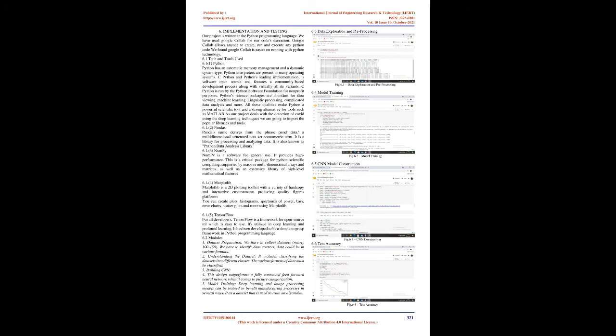5.6 Architecture Diagram. We'll start by gathering the COVID and normal datasets. Those X-ray pictures should be used as input layers. With ImageNet, we may utilize any of the three pre-trained models: ResNet 50, VGG16, and VGG19. We're utilizing the VGG16 architecture here.